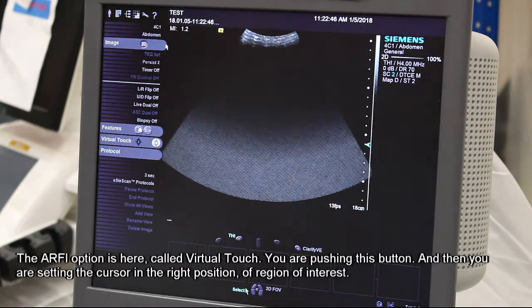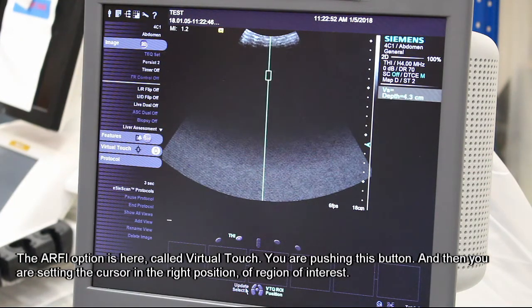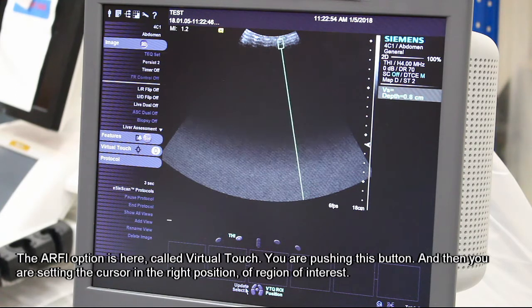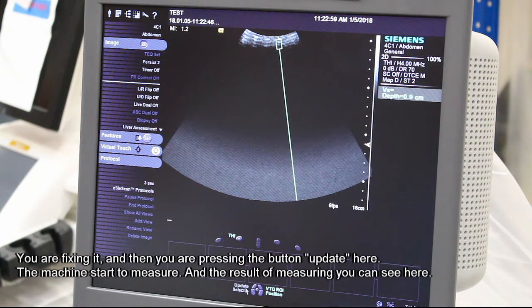The RFI option is here called Virtual Touch. You are pushing this button, and then you are setting your cursor in the right position of a region of your interest. You are fixing it and then you are pressing on the button Update here.